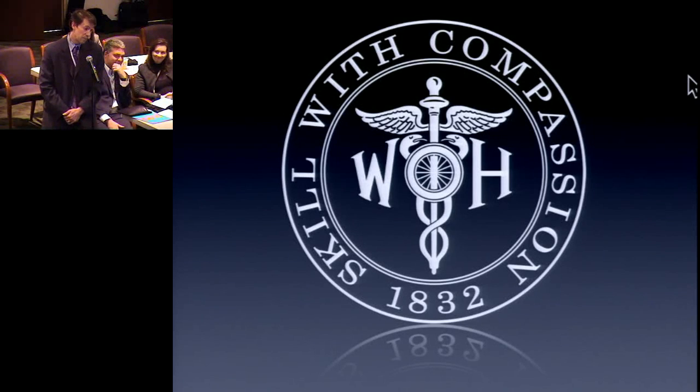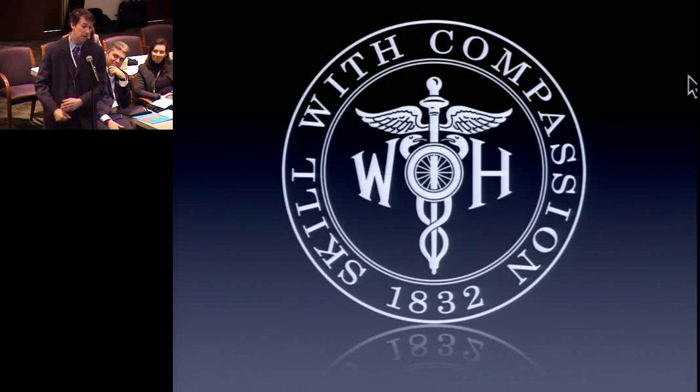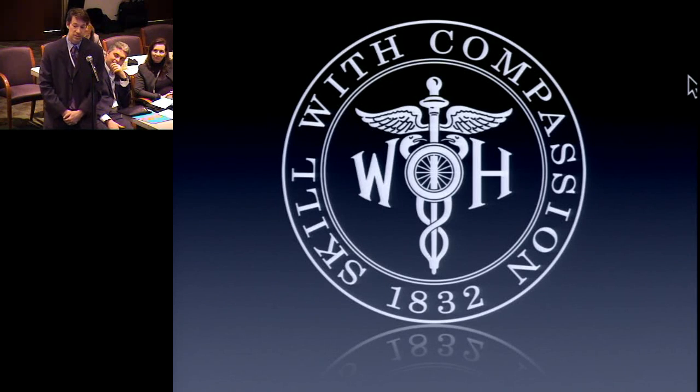And then going forward, my preference personally is to follow a little closer with the OCT. So I like to do an initial disc drawing, get a sense of where I feel that patient's risk is with all the other things, and then I follow my patients with the OCT. And I frankly believe the spectral domain OCT is a big advance. And I agree that the resolution is better than 10. It's more like less than 5 microns. So generally it's pretty good. Again, image quality is important.